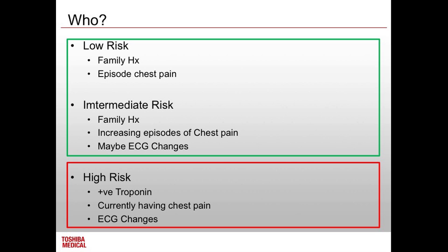Because the one thing that coronary artery CTCA is good at is a negative predictive value. So if you see no pathology there, there's no pathology. Where it gets tricky is when you see some pathology and you want to try and quantify it. That's where it gets a bit tricky. But if there's no pathology there, there's no pathology. So who do we do it on?